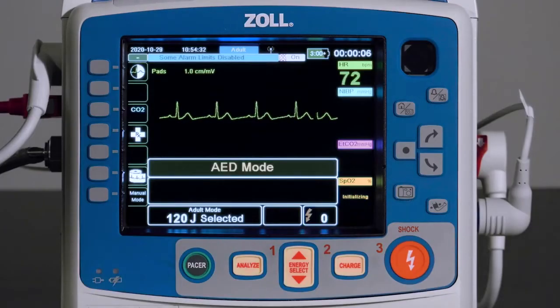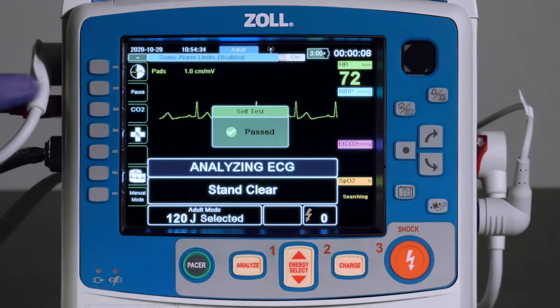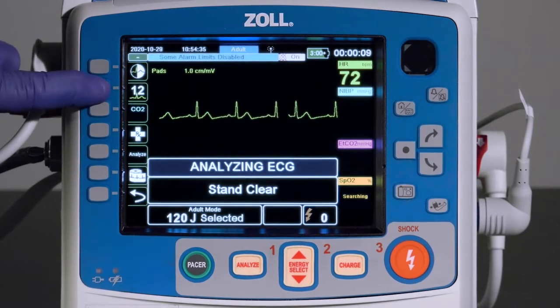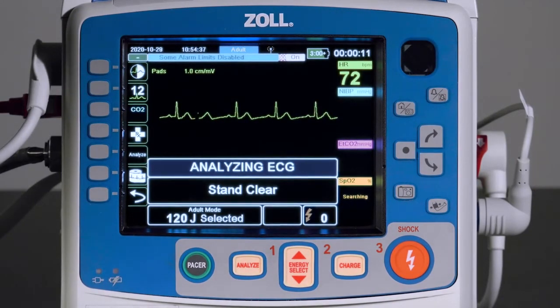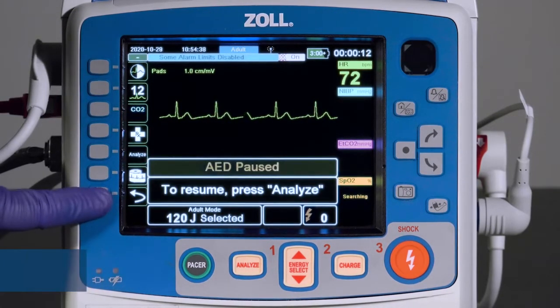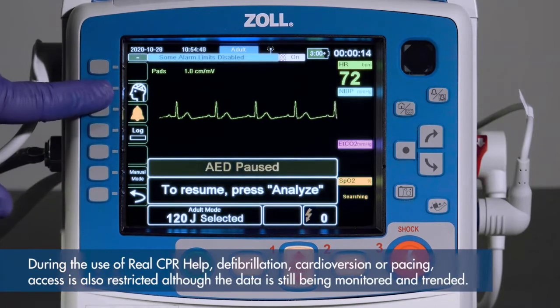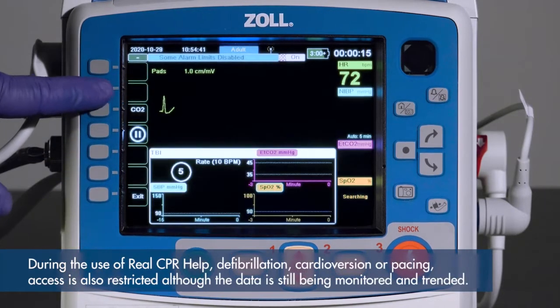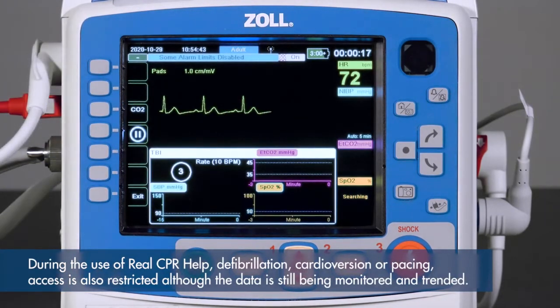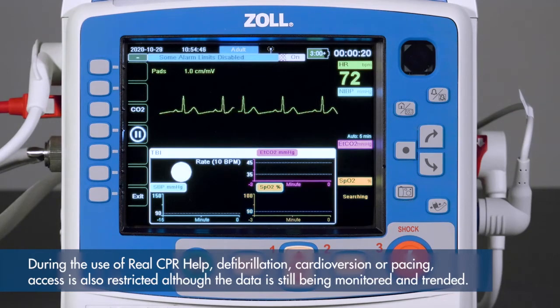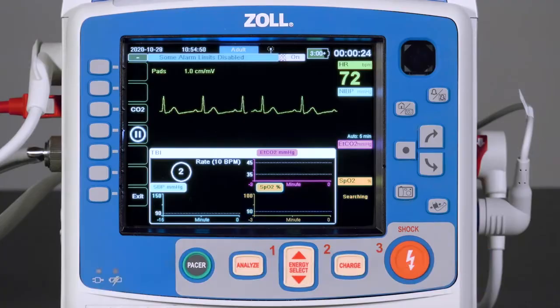Note that if the device is in AED mode, it is only available when the AED function is paused. During the use of real CPR help, defibrillation, cardioversion, or pacing, access is also restricted, although the data is still being monitored and trended.